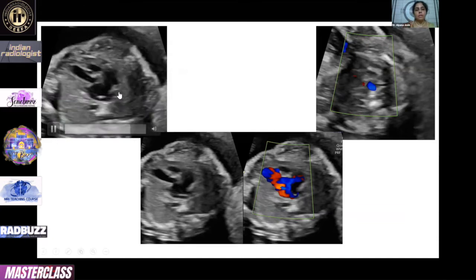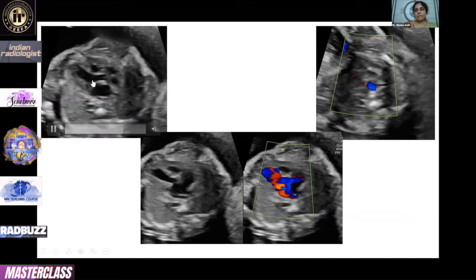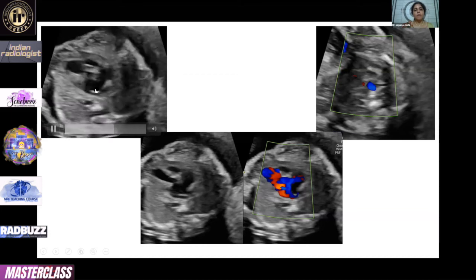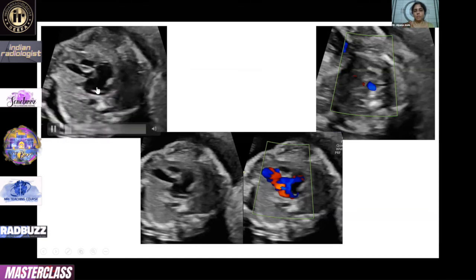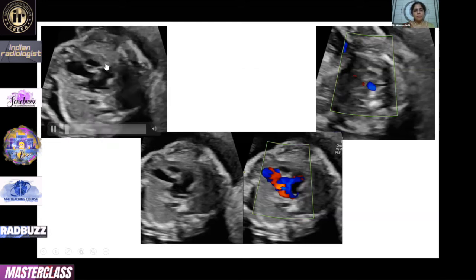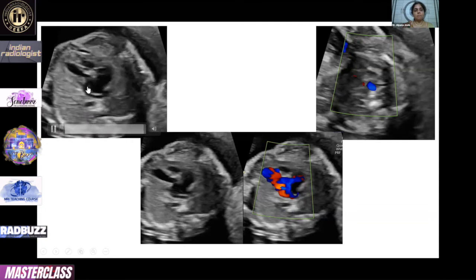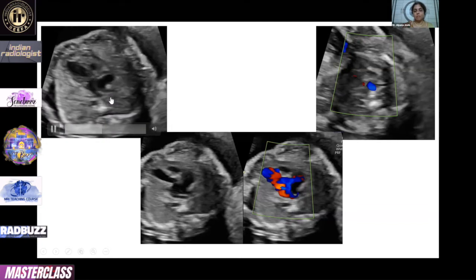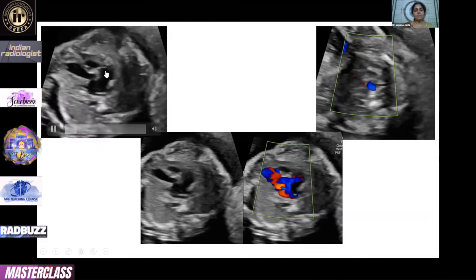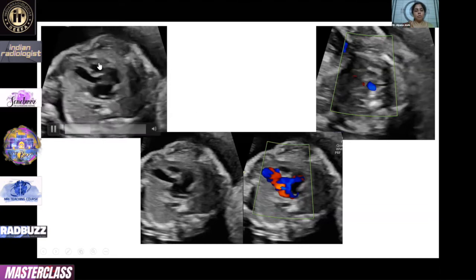If you are looking at this heart, this is the left side. When you are analyzing the heart, in the 4-chamber view, the situs, size, and axis are all normal. You look at the atria: are they two equal-sized atria? Probably this is the right atrium, which is slightly smaller. You can see that this foramen ovale flap is bulging quite a bit, as we've been discussing quite extensively in our previous session. And then, of course, there is a hypertrophied wall of the ventricle.